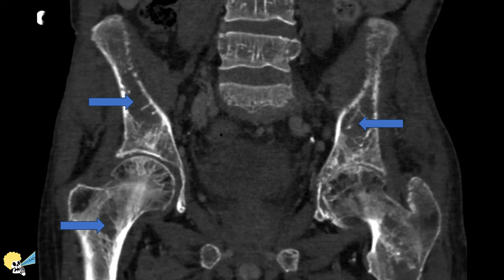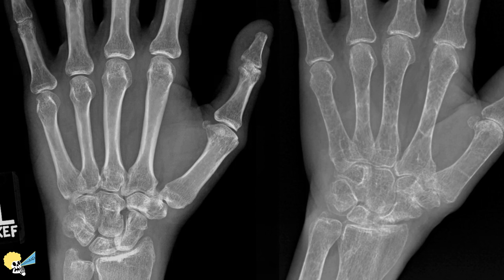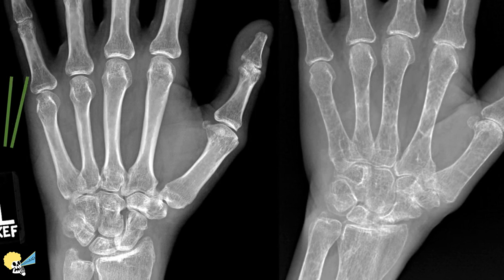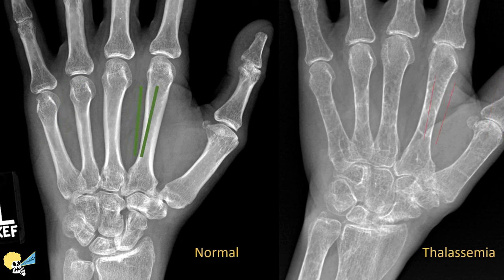Also, keep in mind that similar findings can be seen in patients with osteoporosis and other conditions with poor bone mineralization. For better visualization, we have here hand radiographs of a normal patient and hand radiographs of a patient with thalassemia, where we can clearly see the differences in cortical thickness and medullary expansion.